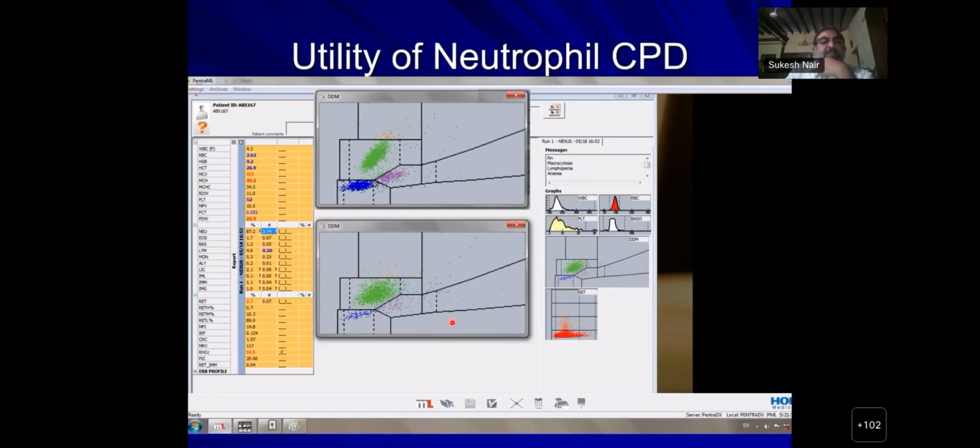So you can see that this patient, in another cell counter, compared to normal, had larger neutrophils because the x-axis is size and the y-axis is scatter. Not scatter, light loss. That means less scatter. So you can see these neutrophils are having less scatter.